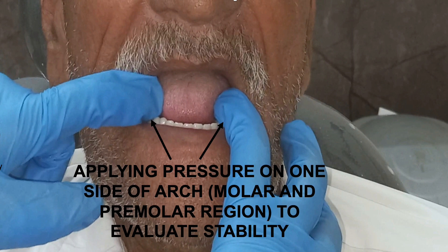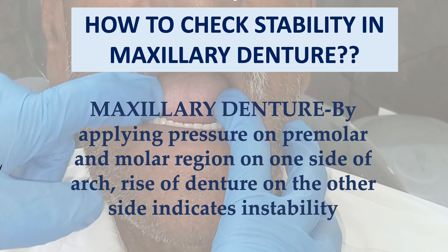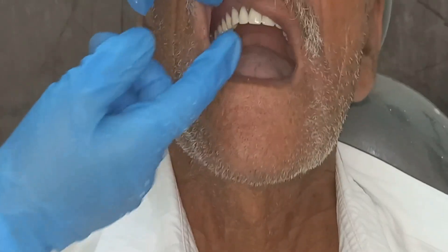This is how you check the stability of the mandibular denture. In the maxillary denture, stability is checked in a similar manner — by applying pressure on the premolar and molar region of one side of the arch. If there is any rise on the other side, it indicates whether the denture is stable or unstable.